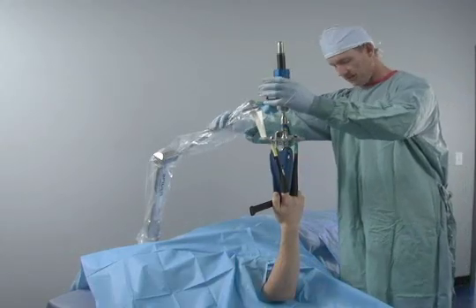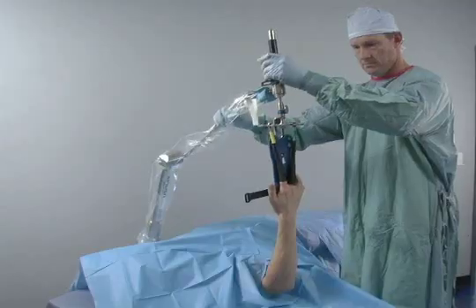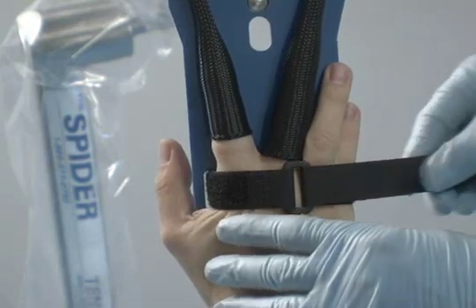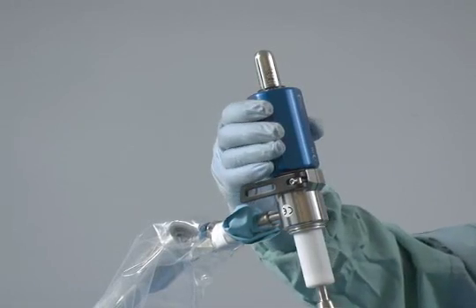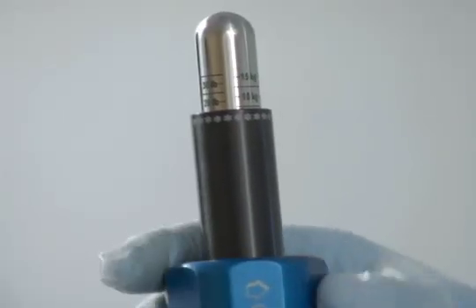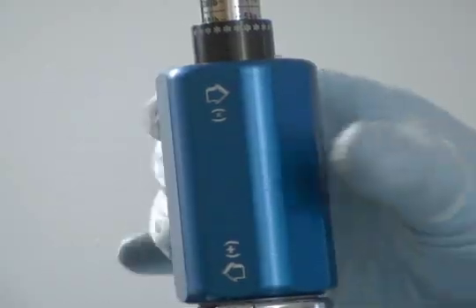After attaching the finger traps, the spider is positioned for surgery. The spider's slender arm and blue traction collar are grasped and the spider is pulled up to position and pretension the arm. The axis of the traction accessory should be in line with the longitudinal axis of the forearm. The bottom of the wrist plate should have slight pressure on the hand, and the wrist strap is then wrapped around the hand to secure it relative to the plate. The traction collar is rotated to adjust traction, with arrows indicating direction, and a scale in both metric and imperial force for reading the amount of traction. Rotating clockwise increases traction while counterclockwise decreases it.